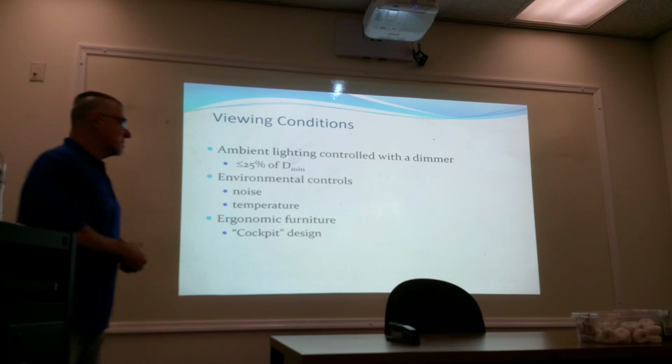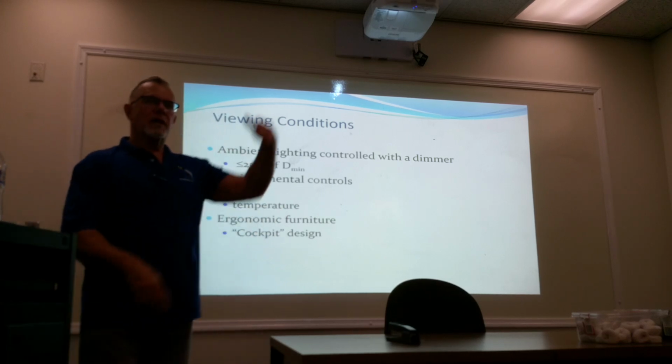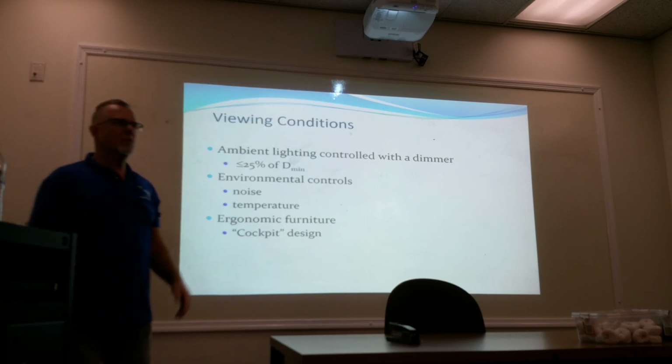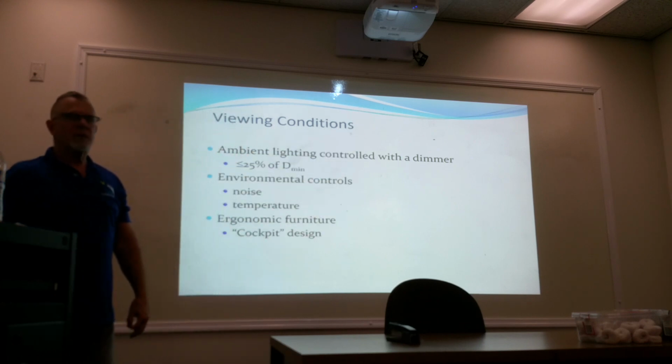So, viewing conditions. In the film world, it's easy. You want to look at X-ray film, you can be in a bright room, dark room, unlit room, whatever. You've got a bright view box, and you can see really what you need to see.